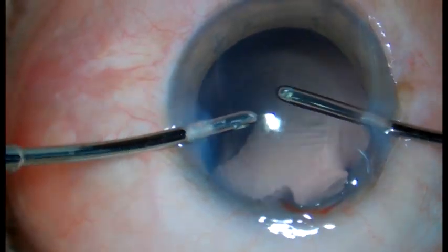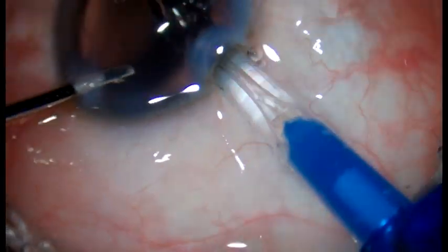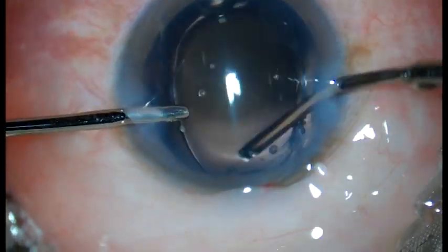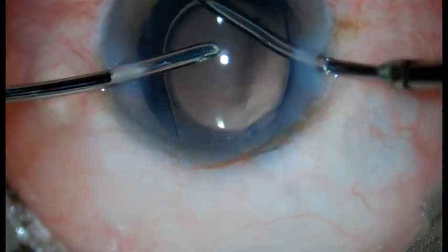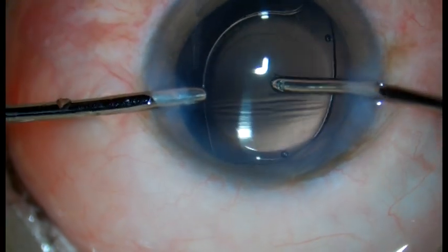It also helps to enlarge and stabilize the pupil. It also helps in hemostasis. All the above properties of viscoelastic can be very well fulfilled by continuous irrigation of BSS from the side port.